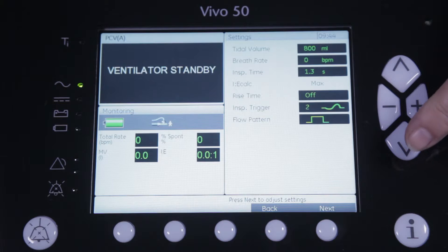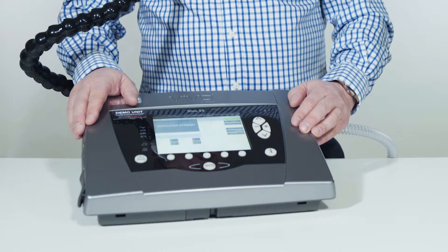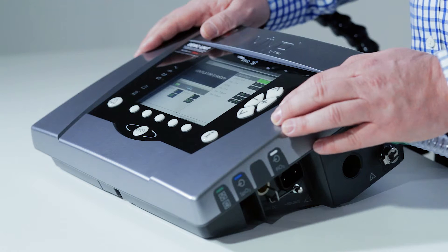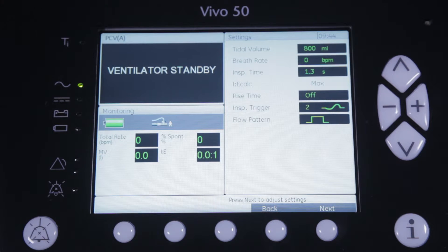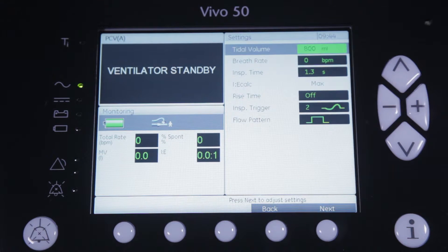The number of settings have been reduced and optimized for the MPV application. This allows you to set MPV in a quick and easy way. First you select a certain tidal volume you want to deliver to the patient — in this case we've chosen 800ml.